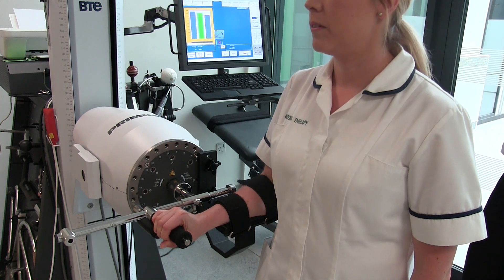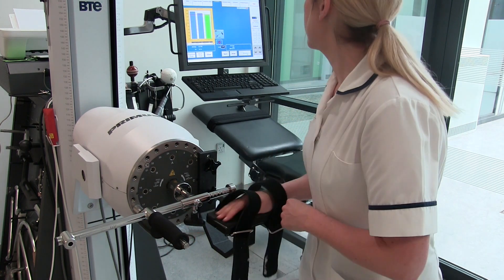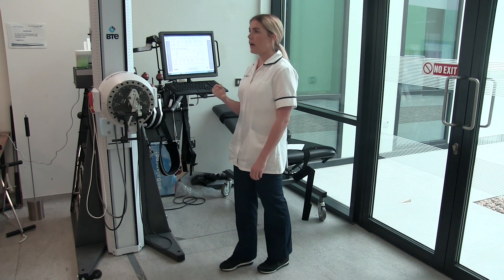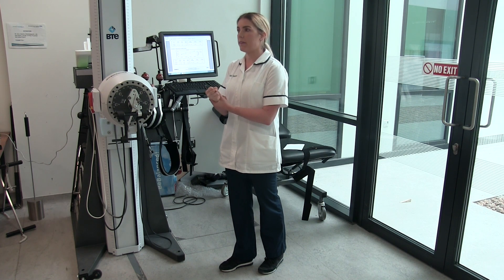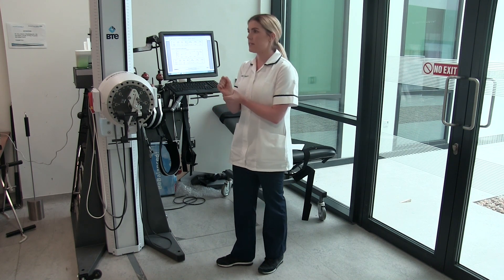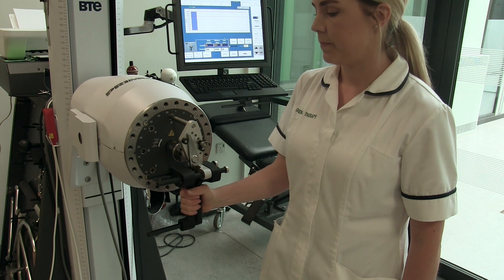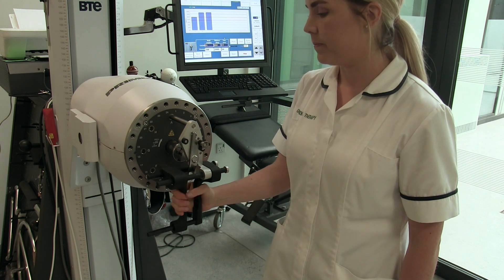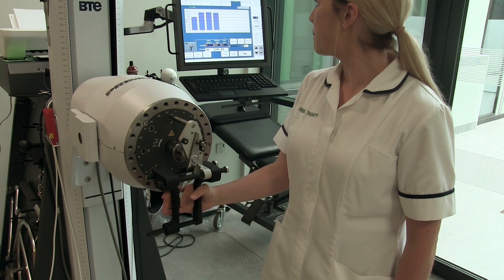The percentage difference we've seen is a 173.1% improvement from her original session. What she's struggled with as well is being able to get a nice tight grip, because if you're unable to actively extend the wrist you can't get that power in your grip to do your everyday activities. As the wrist has become more stable and she's been able to actively extend and maintain that stability, we've incorporated the isotonic hand grip exercise to build that up, and you can see she's made really good progress with that.